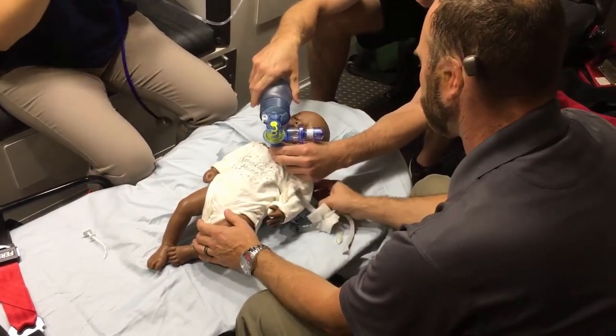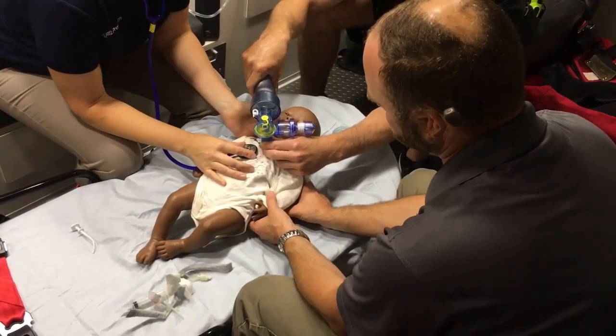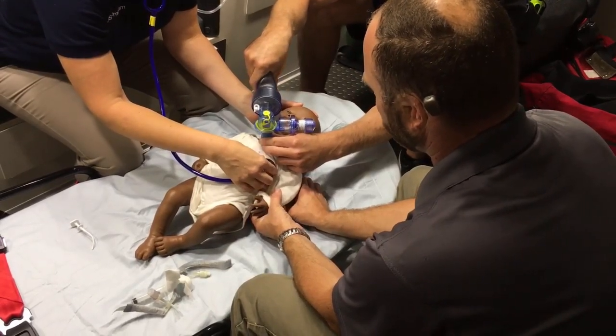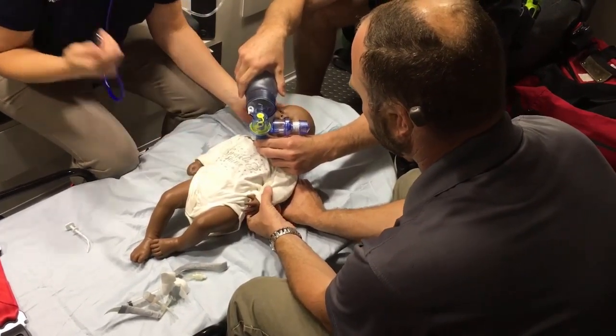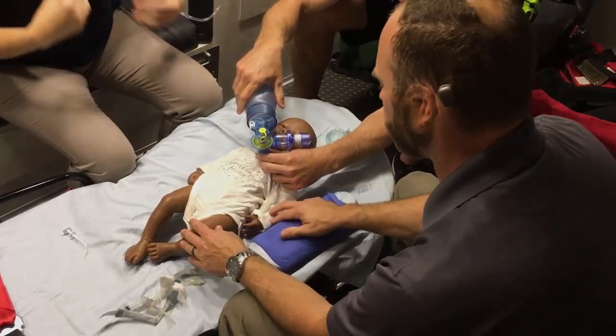How is she bagging? It's much easier. I'm going to take a listen here — I've got much better aeration. How does she look on the monitor? She's actually picking her heart rate back up and her oxygen saturation is coming up too. Her color looks much better. Good job, everybody.